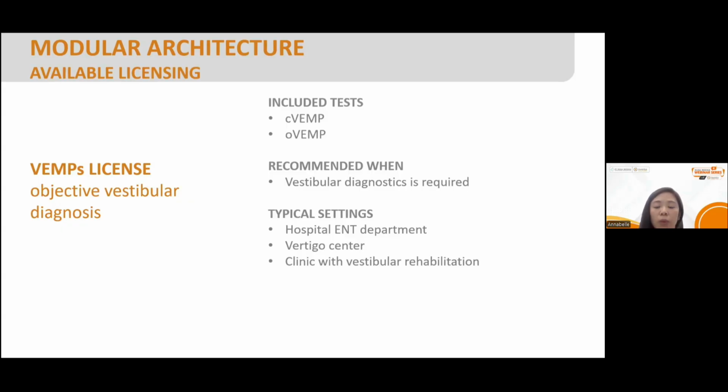Like you get patients with a vestibular problem, or they just report that they have dizziness or vertigo, and if it is not a very obvious problem like BPPV or whatever, then you want to go for the diagnosis of the vestibular system: which part, the site of lesion, and how we can help with rehabilitation. Then we go for the vestibular diagnostics. Okay.